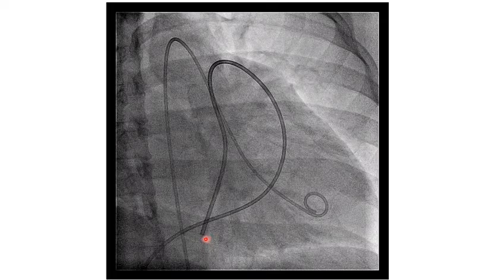How will you make out in the cath lab that the catheter is actually wedged? Sir, it will not move, it will be fixed. Then the waveform will change from the pulmonary artery waveform to a venous waveform. And sir, saturation will be 100%. You suck the blood and you will get 100% saturation. And also you can see some respiratory variation of the pulmonary venous pressure, while pulmonary artery pressure will not change with respiration. Very good.